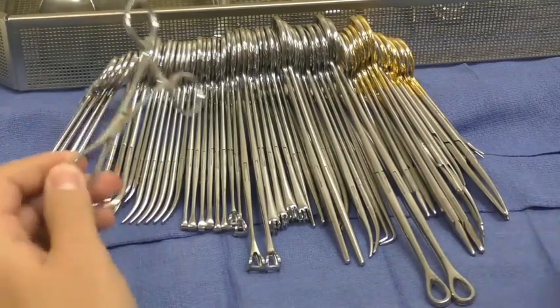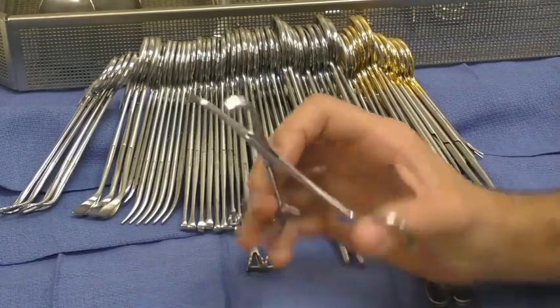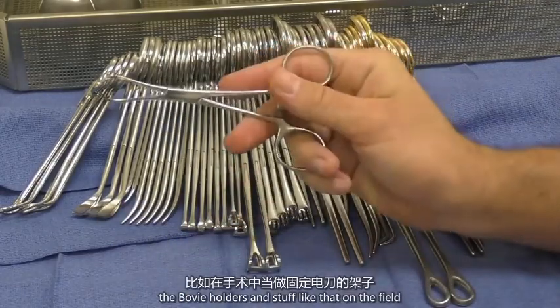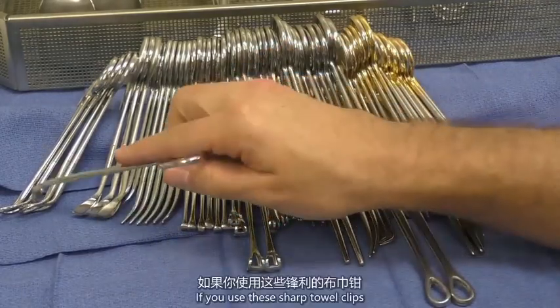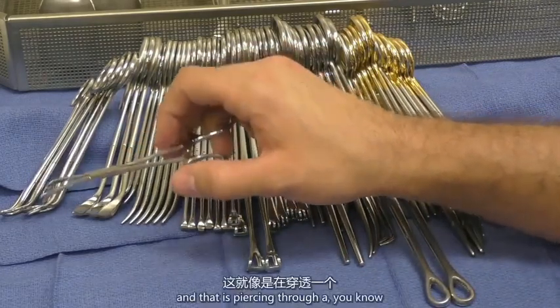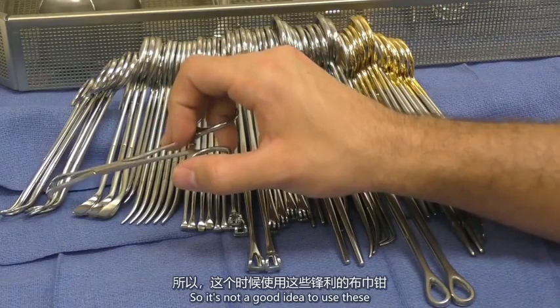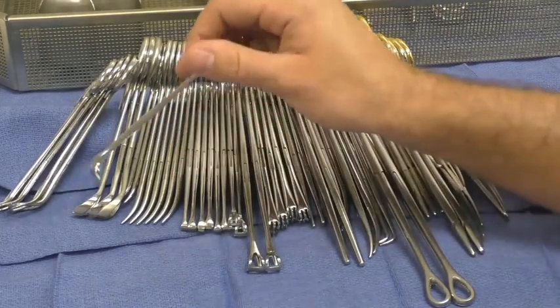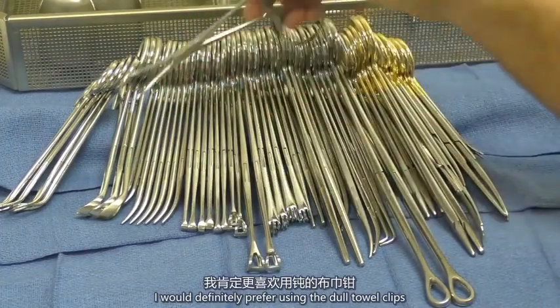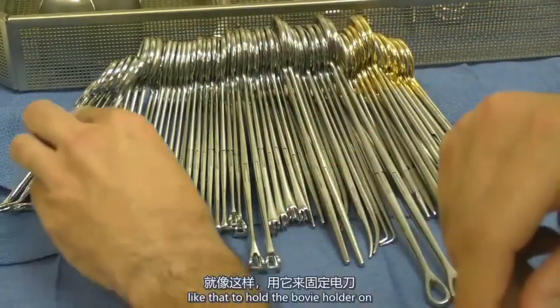Next we have the dull towel clip, also known as the Lorna towel clamp. I personally like to use these for the bovie holders and stuff like that on the field. If you use these sharp towel clips, you're going to be piercing through the drapes themselves, and that is piercing through a somewhat sterile field. So it's not a good idea to use these sharp towel clips for that reason. I definitely prefer using the dull towel clips. And if I don't have these available, I'll just use a Kelly clamp or something like that to hold the bovie holder on.